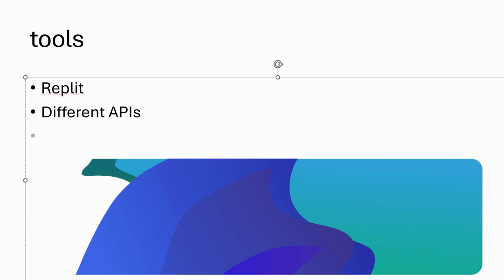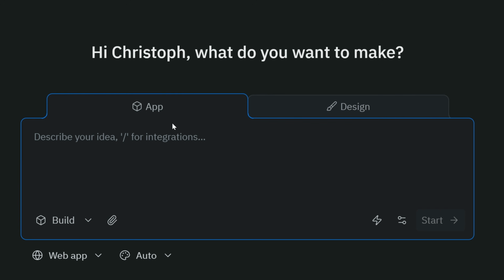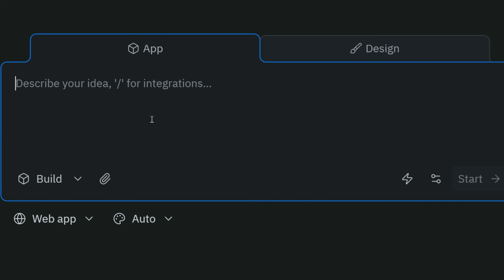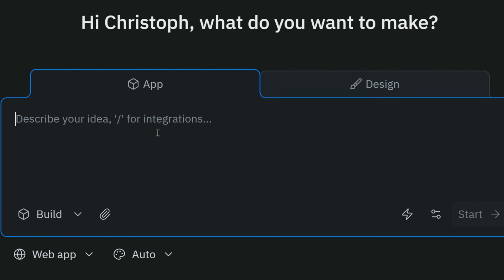So let's go to our program here, Replit, and this is where we now say what we want to build. So we start by telling Replit what we actually want to achieve.